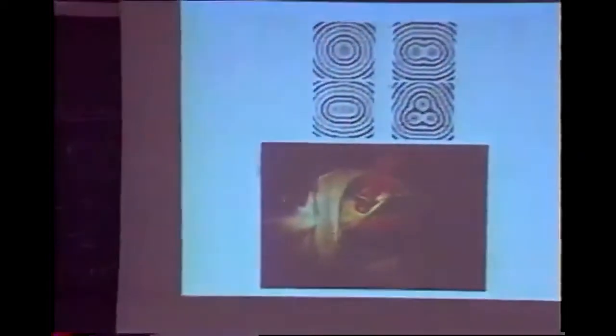Here's an example of multiple optical fibers going, in this case, into the brain. So we have the patient here with a template onto the brain, and all these optical fibers coming in, essentially to give a light distribution throughout the whole volume.